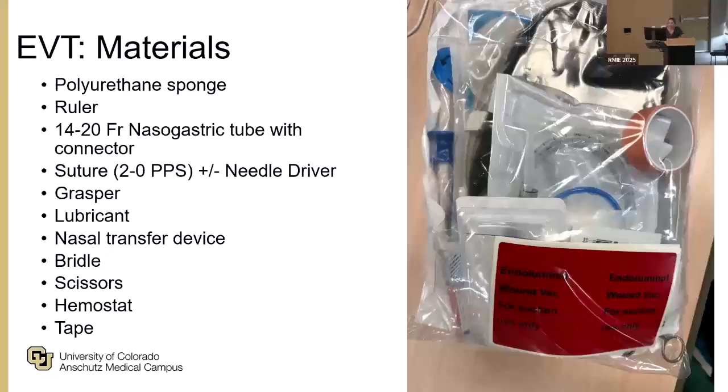And then Lauren, our charge nurse, also made these great stickers in red here that we attach to our tube, so that our floor nurses know that this tube is not for feeding and should only be placed to suction.